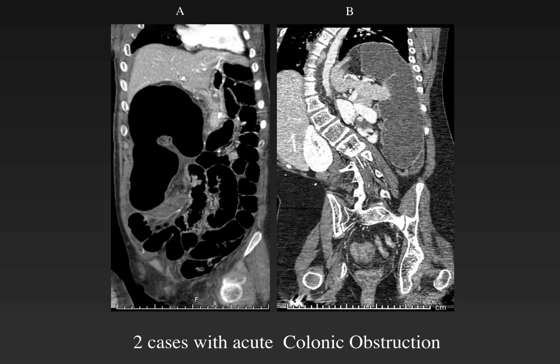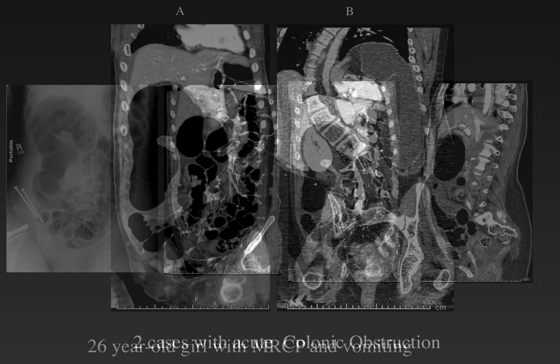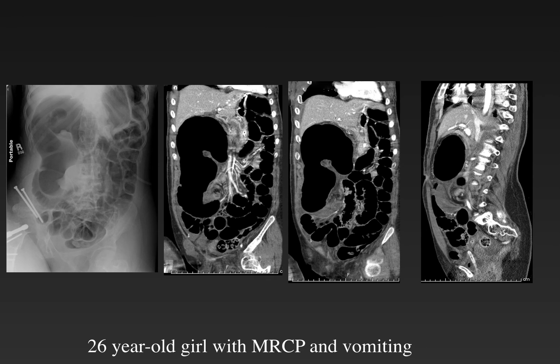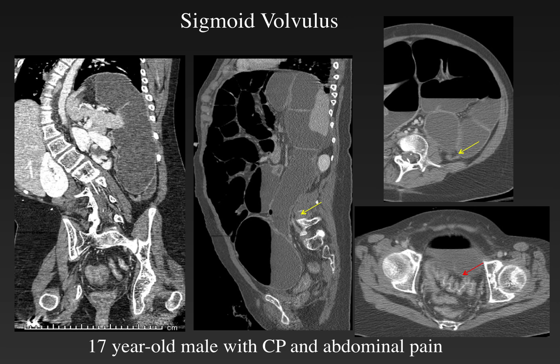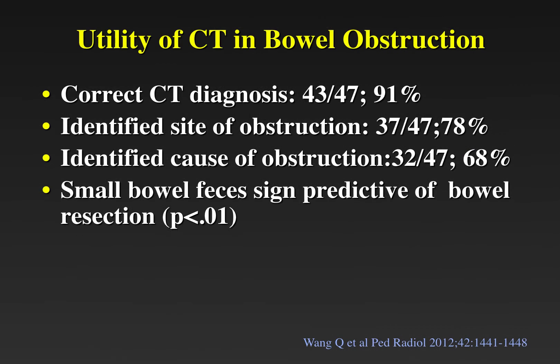Here are two cases of acute colonic obstruction. The first case is a 26-year-old girl with mental retardation and cerebral palsy and vomiting. She has a focally dilated right colon with air-filled dilated small bowel and a mesenteric swirl sign in the right lower quadrant, rather than in the midline upper abdomen as seen with malrotation, resulting from cecal volvulus and mesenteric twisting. The second child, a 17-year-old with cerebral palsy and abdominal pain, has a dilated fluid-filled left colon and collapsed distal sigmoid in the pelvis, with an acute change in caliber representing sigmoid volvulus.